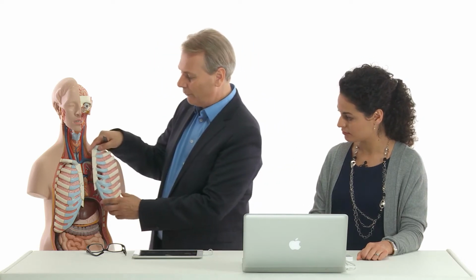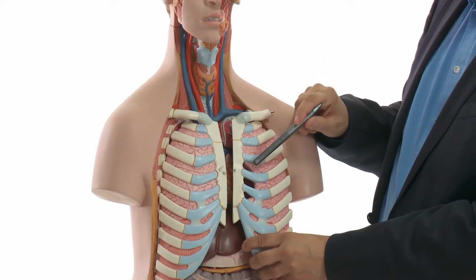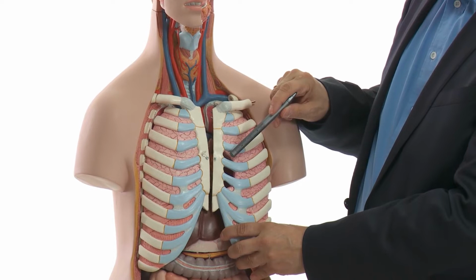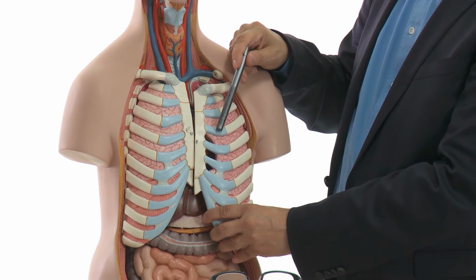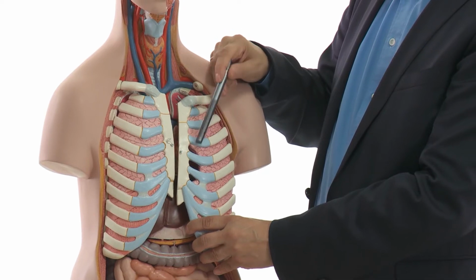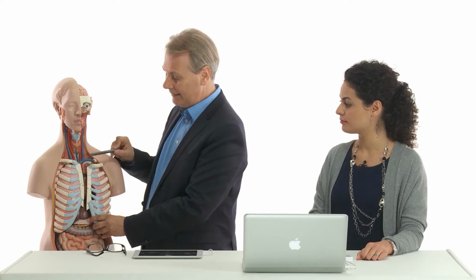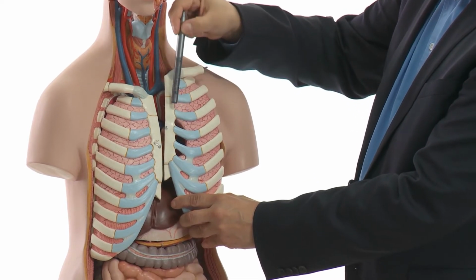And the last thing we want to mention is the role of the lungs and the ribs. Yes, because if you take a close look, the problem we have is that we can neither image through the lung nor through bone, and the imaging windows are sometimes quite small. So to get the heart in your field of view, you can use respiration to your advantage. For example, you can let the patients exhale, thereby the lung will move more lateral and open up a window. But sometimes inspiration is just as good, because by inspiration you can move the heart position up and down, and thereby it can come into your field of view.